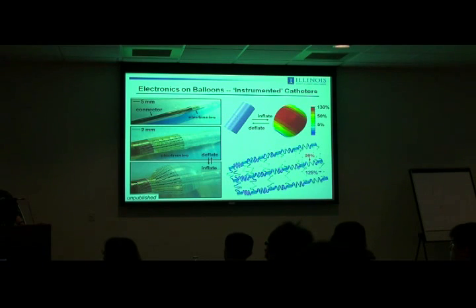So okay, this is a perfect lead into the next two slides. There are two ways to do this ablation therapy. One is in this epicardial mode, which is on the outer surface of the heart. That's open heart. The other, which is gaining popularity because it's a less invasive procedure, is endocardial. In that case, the mapping and the ablation happens via a catheter that runs up into the interior surface of the heart through an artery or vein.